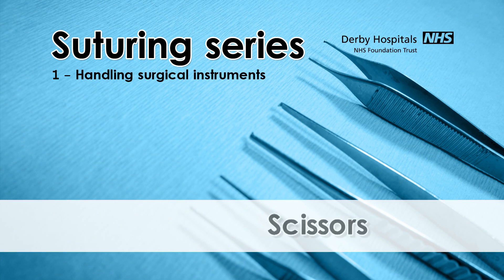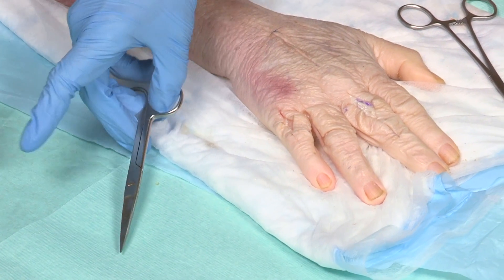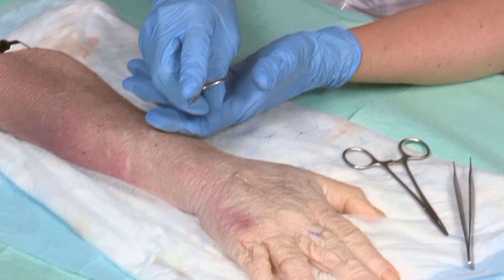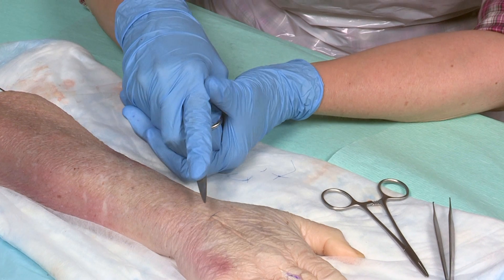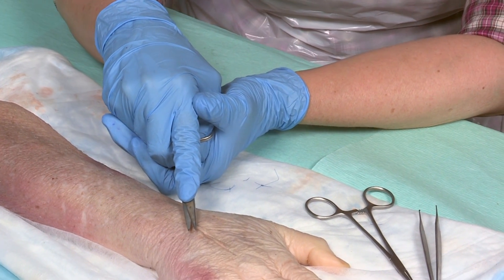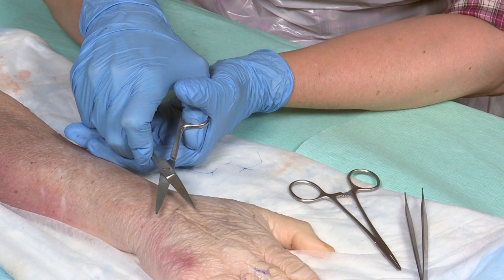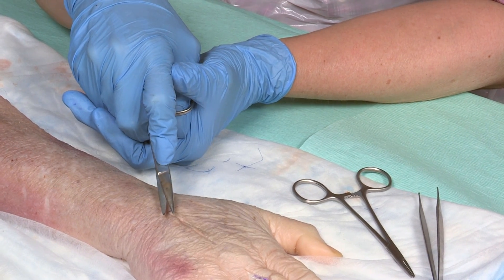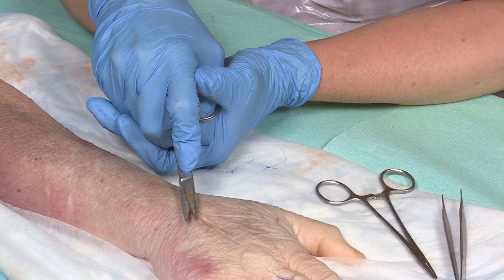Always hold the scissors with the ring finger and thumb through the holes and the middle finger behind for support. Point your index finger close to the fulcrum of the scissors to direct them. Use the tips of the fingers. It's always a good idea to stabilise your hand when you cut. Only open the scissor blades enough to capture the suture, as opening them very widely increases the risk of causing unintentional damage to adjacent tissues.